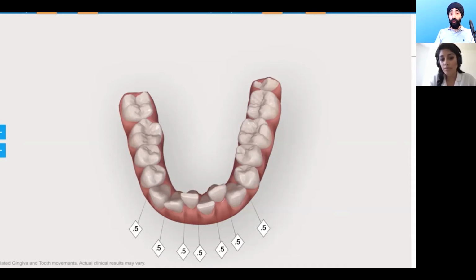I think what I found useful in cases like these is to use a measuring device. It's a very normal measuring device. In this case, I use a digital caliper to measure beforehand, and then I use my soft Lex disc, or maybe even a burr, very carefully under high magnification, just to remove the incisal part where it's a bit more triangular, and then measure it again. I find that sometimes in my hands that can work better than using the IPR gauge, because between that lower left 2 and lower left 1, I might find it quite difficult.